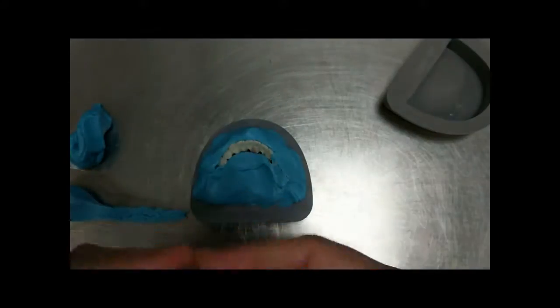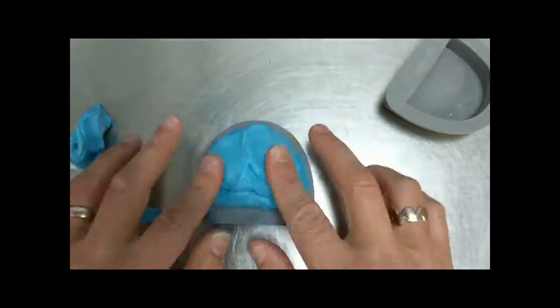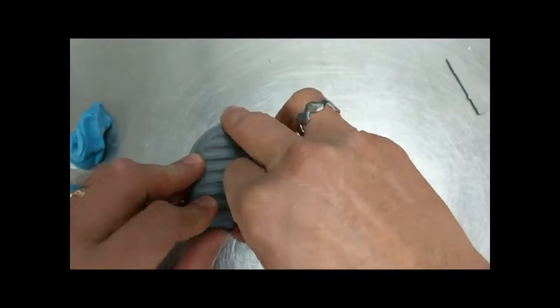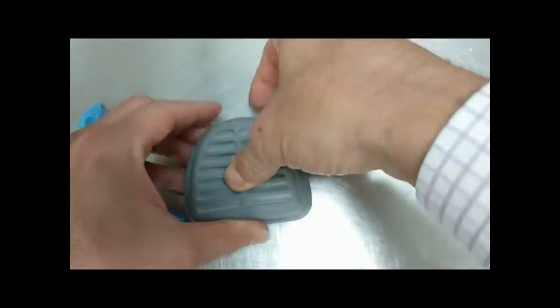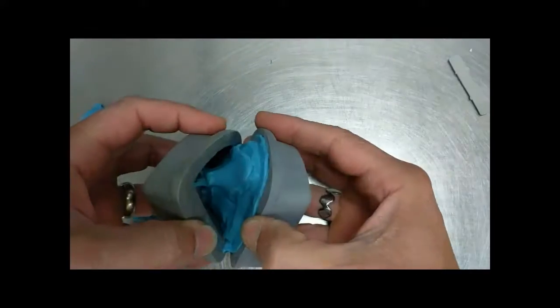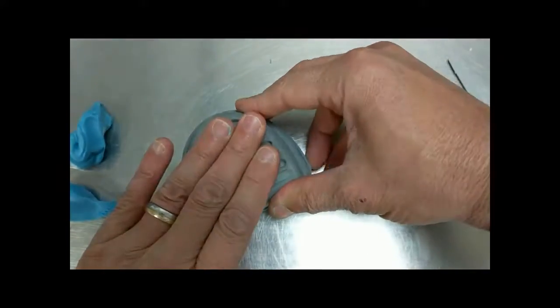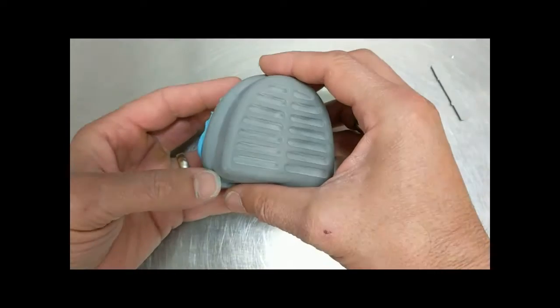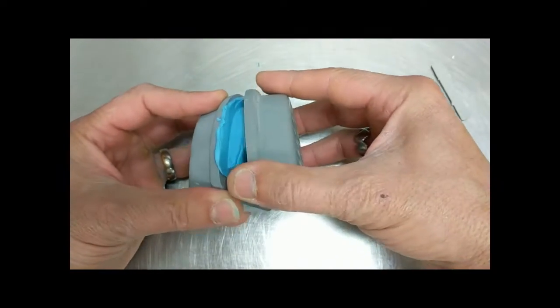Well within the setting time, carefully ensure that the putty has touched all parts of the prosthetic. This part is very important because if there are voids, then they'll have to be adjusted and there'll be a little bit of guesswork on the laboratory's end. Once the putty is set, the flask can be separated.